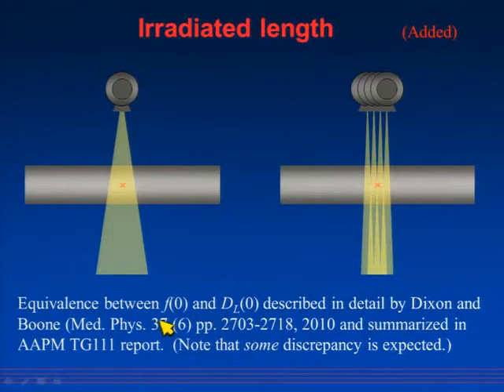And I want to add one concept here that's very important, and it's been confusing to people to understand. Well, what do you do for a stationary table? If you stop to think about it, if you have a stationary table, and you have this point, and you irradiate it this way with, say, a cone beam, or you irradiate it this way by continually exposing and moving it through, it really doesn't matter.